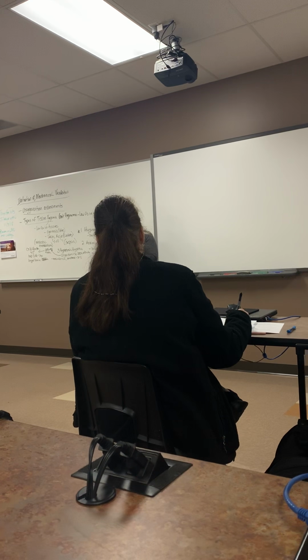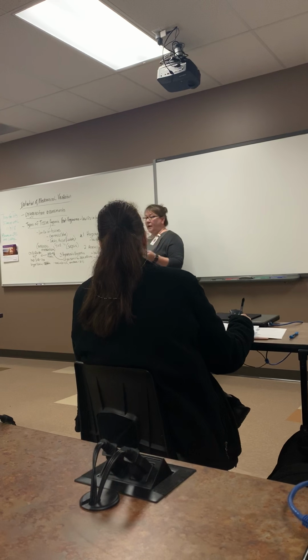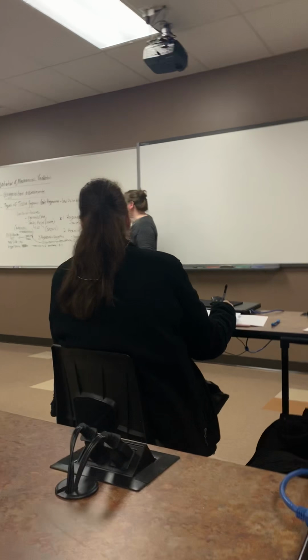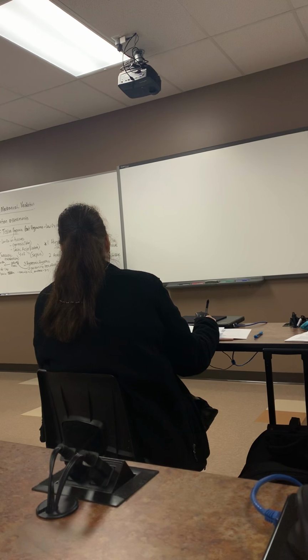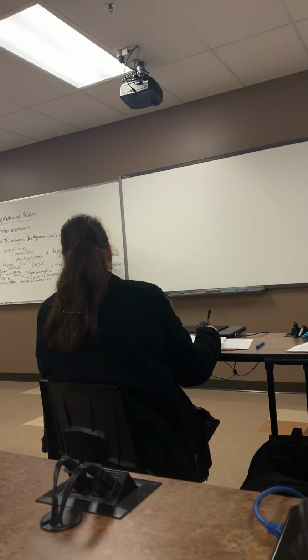Everybody gets a smoke inhalation patient, or a patient in a car in the garage, something like that. So these will be very important things to know. Co-ox and what? Hemoximetry, H-E-M-O-X-I-M-E-T-R-Y. And what do you say after that? Carboxyhemoglobin. You might also see just the words carboxyhemoglobin level.